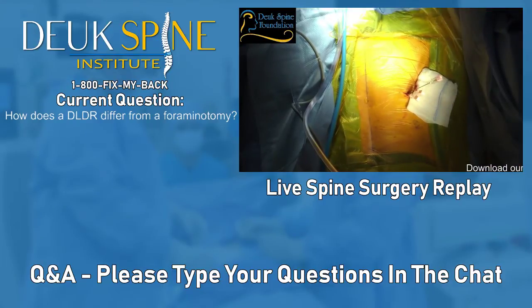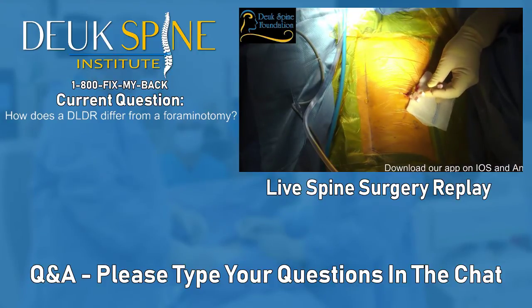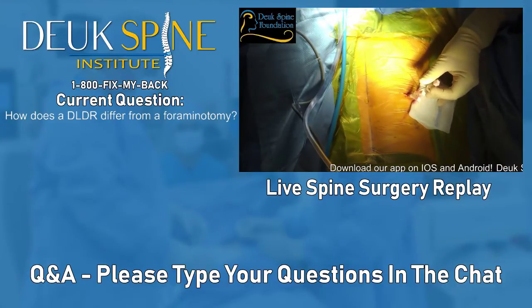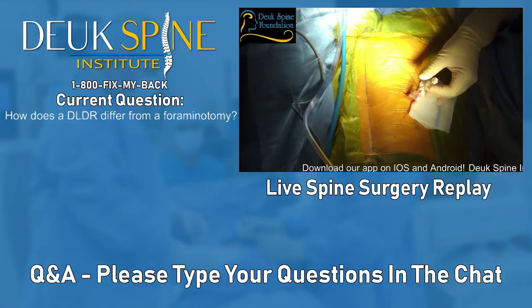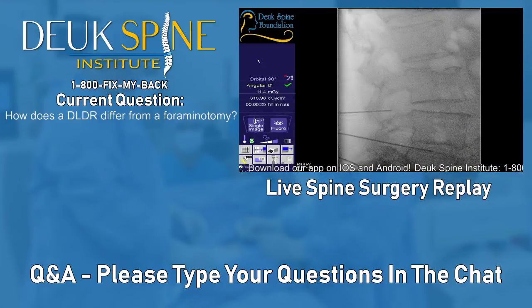So on open back surgeries I always do a wide decompression with a Smith-Petersen osteotomy, not just to decompress the nerve root in the foramen and lateral recess, but also to allow correction of alignment to get the patient lordotic and straightened in the sagittal plane.